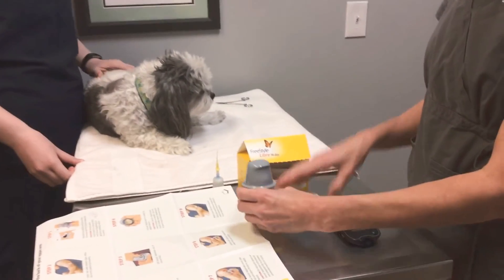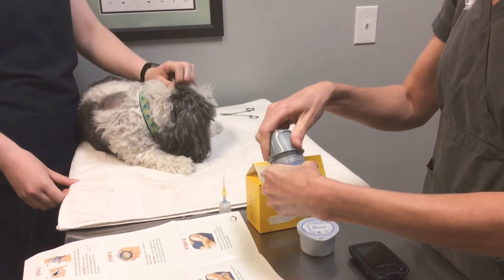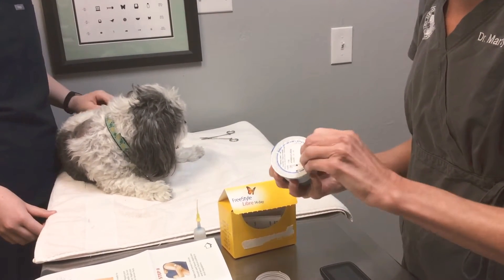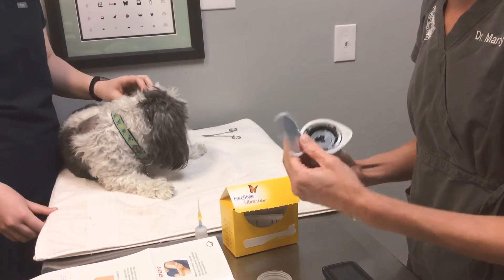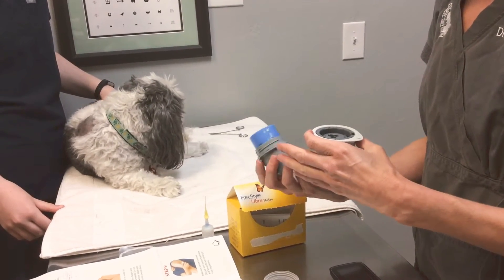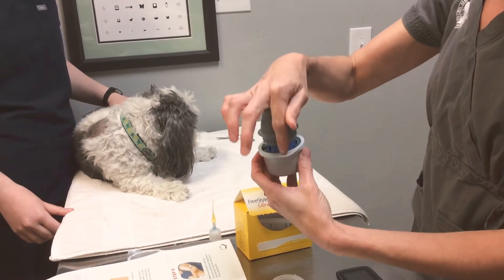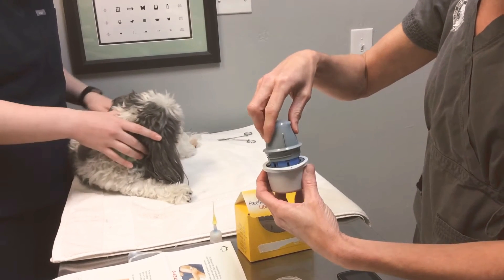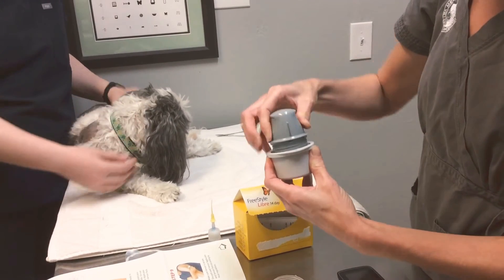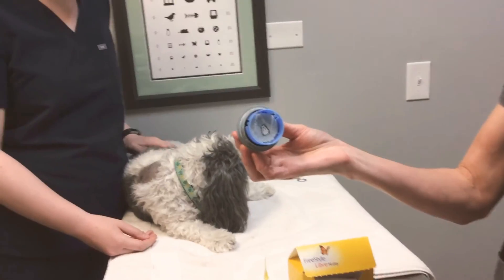When you open it, there'll be two pieces. This is the part that's going to allow you to place the glucometer — you unscrew it like that, and then we're going to open the actual glucometer. The instructions say to line up the dark line here, making sure that it lines up with the line on the glucometer. I'm going to go ahead and place it down and press down firmly. Then we pick it up like this, and the glucometer is now loaded.